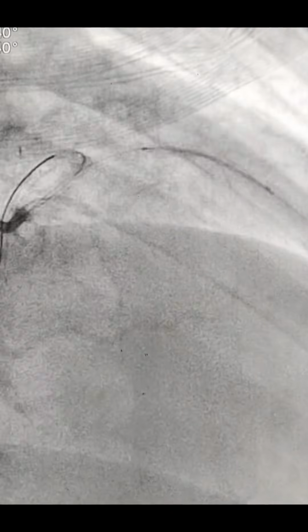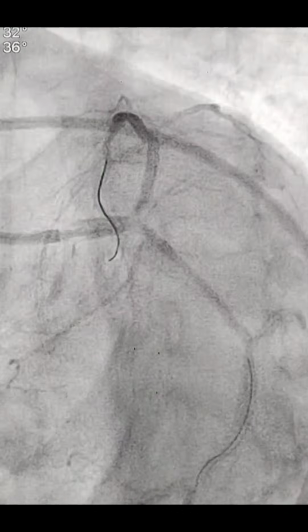With IVUS guidance, we decided to put a stent of 2.25 by 24 in this mid LAD in the bend. Generally in the mid LAD we used to stent like 2.5, but with the IVUS guidance the area was small, so we took a 2.25 stent, and then we inflated the stent at around 12 atmospheric pressure. And now this was the picture.